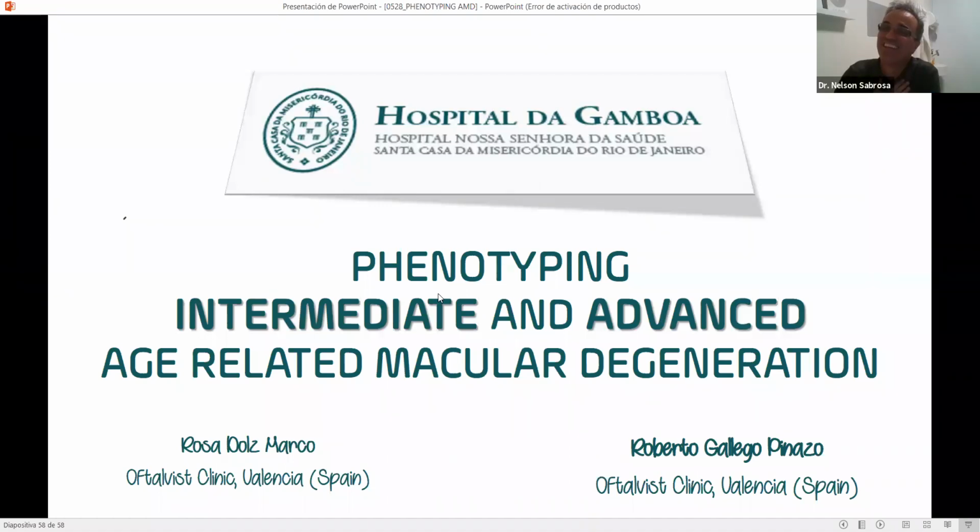You're saying how to use it. And that's the thing that I like the most about OCTA in patients with intermediate AMD, to look at the B scan with the flow overlay, these nascent impending lesions that we were showing, to try to rule out the presence of neovascularization in cases with drusenoid PEDs, acquired vitelliform lesions with partial reabsorption of the vitelliform material. There are many, many cases where OCTA is extremely useful in our patients.